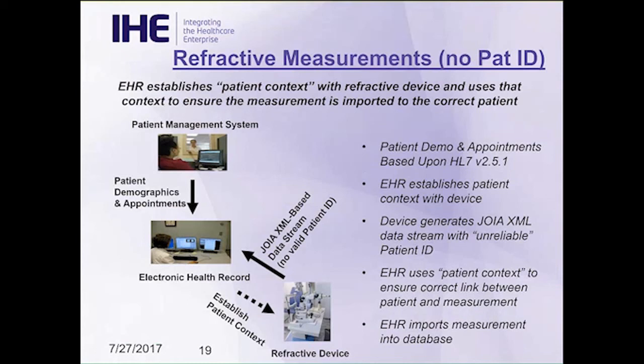The first workflow is basically with no patient ID. Quite often when I connect to these devices, we typically do it with proprietary mechanisms. And often those devices do not have any capability to capture or know a valid patient ID. So you have to actually establish a patient context between your EHR and the refractive device, where I know I'm opening up patient Jane Smith, and then I start to receive the refractive measurements based on that patient. That capability, which is something we do today in a proprietary fashion, really doesn't change here.